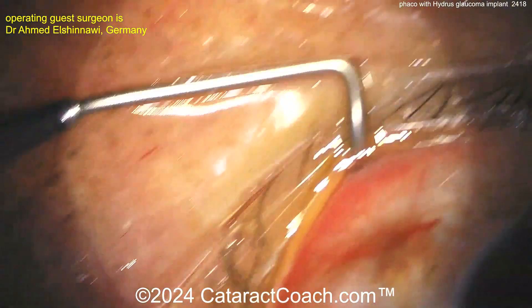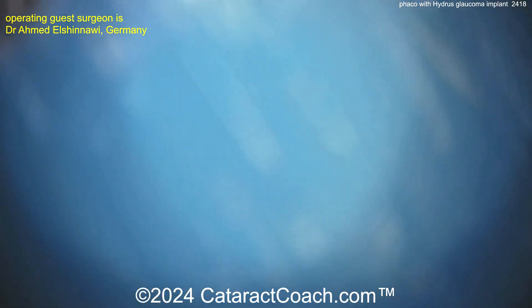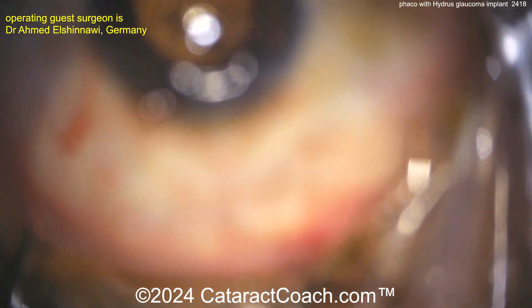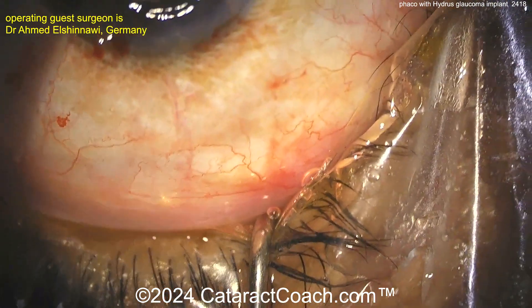You can see the microscope being moved and the patient's head brought back into position — here is our traditional view like we do for cataract surgery. Center this up a little bit, put the I/A probe in the eye, remove your viscoelastic, seal up the incisions, and call it a day. The patient is going to have a nice outcome.